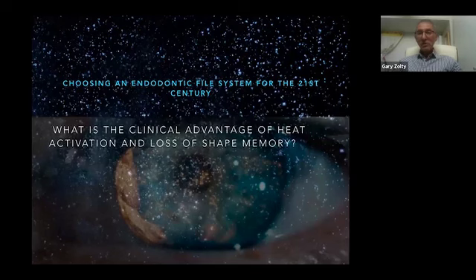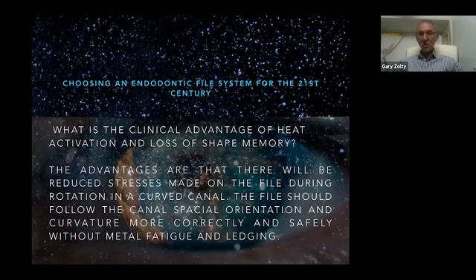So what's the clinical advantage of heat activation and loss of shape memory? The advantages are that there will be reduced stresses made on the file during rotation in a curved canal. The file should follow the canal spatial orientation and curvature more correctly and safely without metal fatigue and ledging.